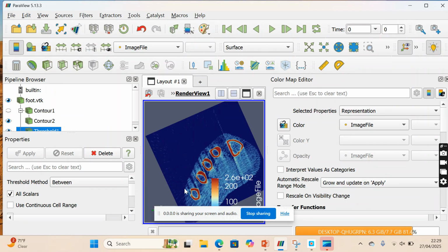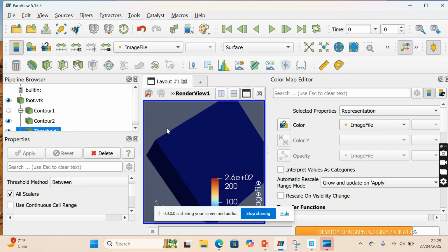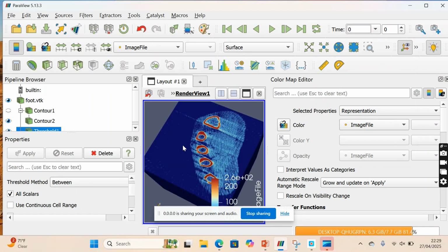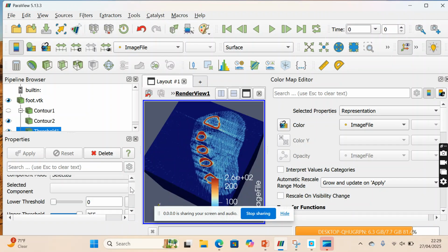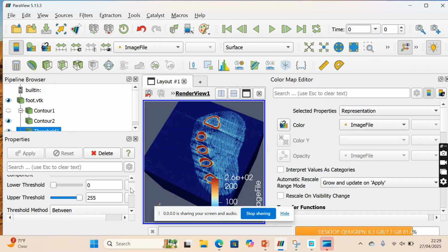I'll see the concentration, the bone, and then I can determine pressure, where more pressure is concentrated, and then I can use it to study. So this is my presentation. Thank you for sharing. Thank you, audience.